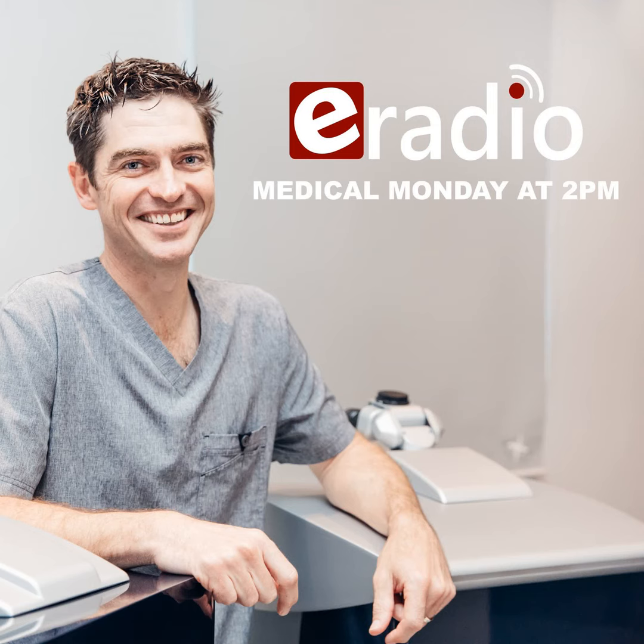Wow. So if you think of the eye, it intrinsically moves. You can follow a target, you can fixate on a target, but when we lie down, the eye actually changes position a little bit. It turns. But these lasers have been developed to track you in the vertical, the horizontal, the oblique axis, and the torsional axis, so if your eye is twisting. Theoretically, you could read a book while the laser is delivering its pulses. Wow. And this laser is going to follow you. It's got a tracking system built in.